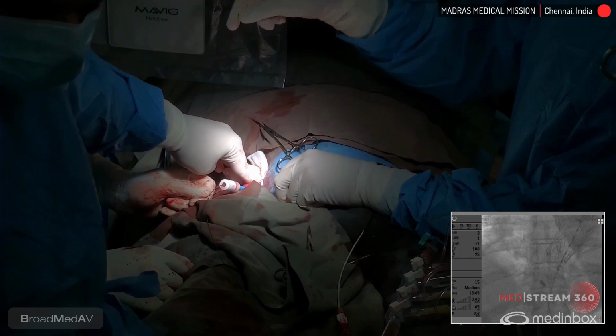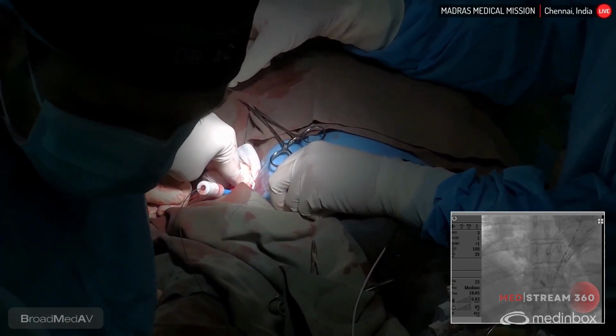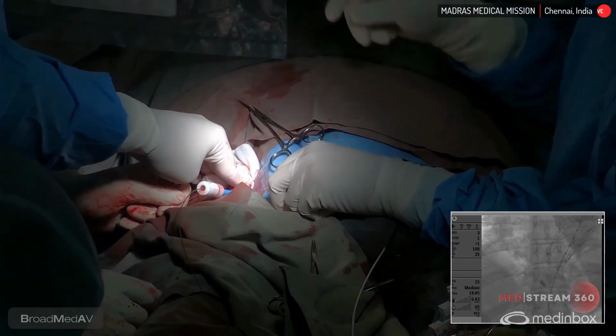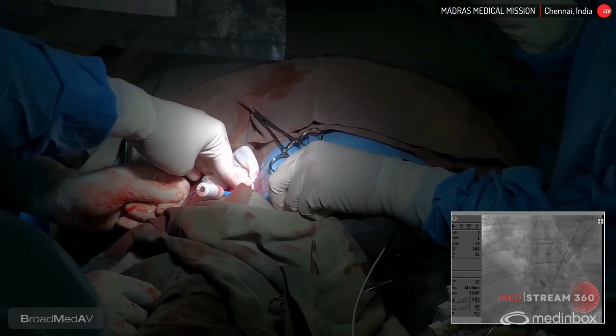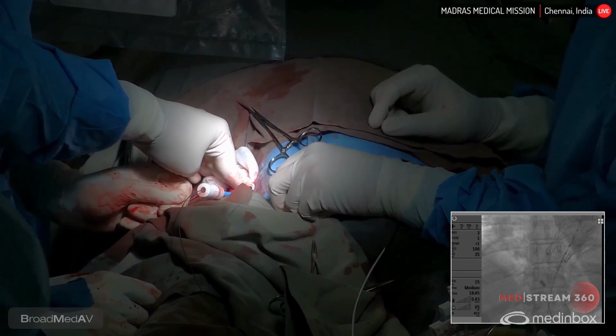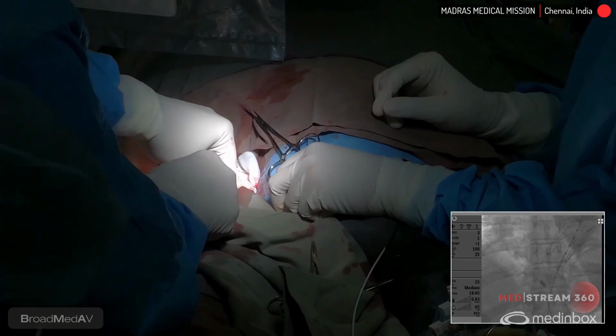The ProGlide has 2 suture threads. One is the blue and longer one, which is known as the rail suture, and the other one, the white one, is known as the non-rail suture. The blue suture is used to push the knot, and the white one is used to lock the knot. Locking of the knot should be done lastly, before you remove the sheath and wire.